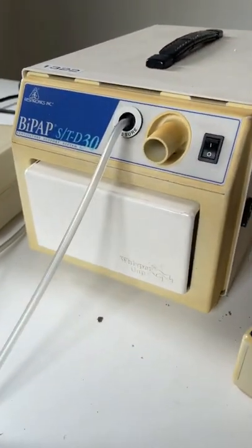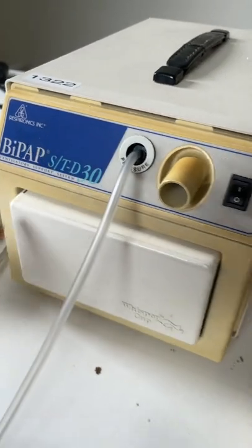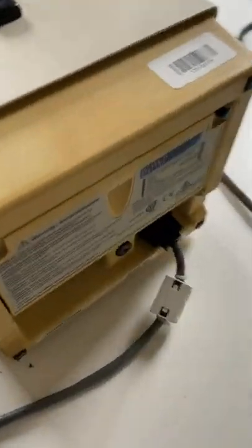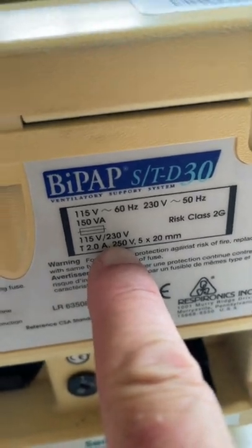G'day mates, I think I've just done a big boo-boo. I've been stuffing around with this old BiPAP from the late 1980s, just trying to get it going. I want to see what it sounds like. I've come around the back to check the voltage, and I see it says 115 to 230 volts — great, since we're on 230 volts here in Australia.